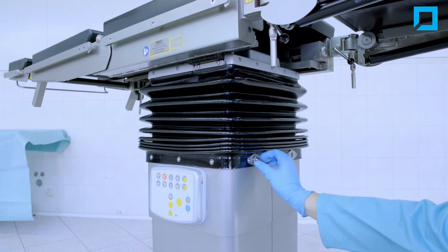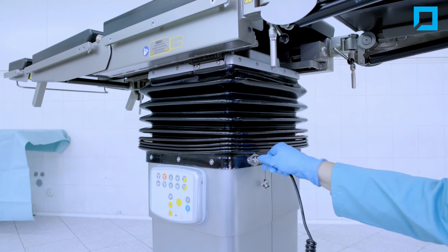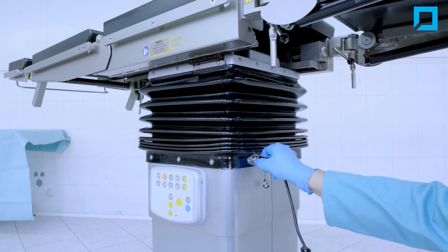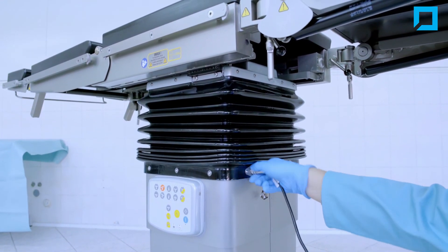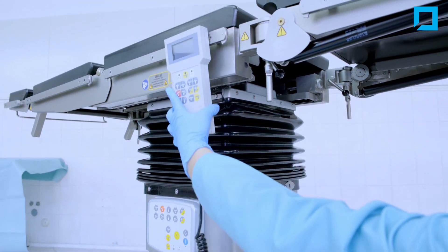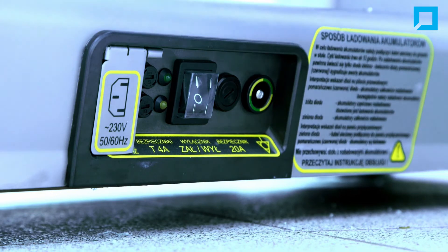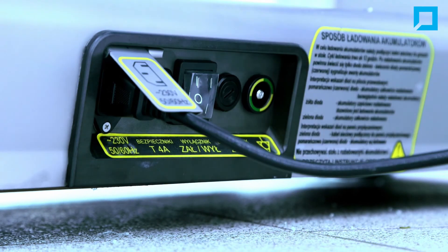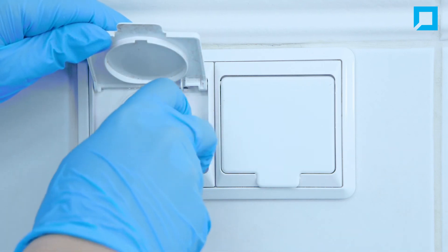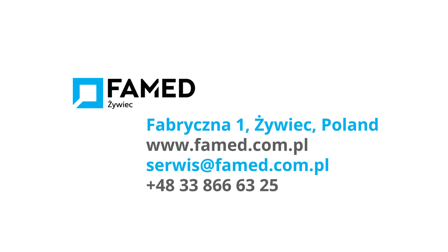Plug in the remote control. Lock the table and turn on the power.